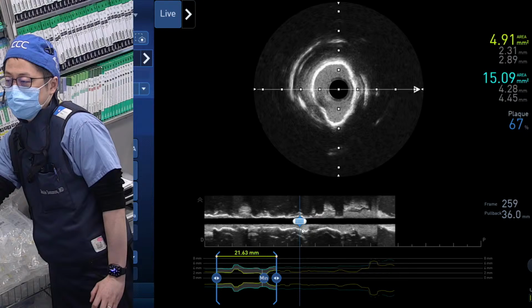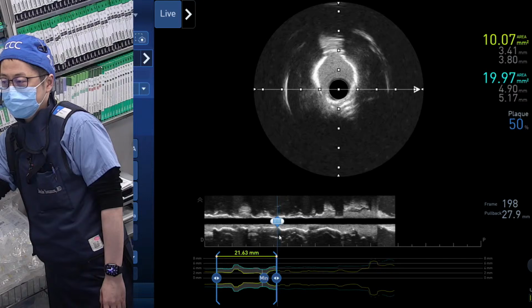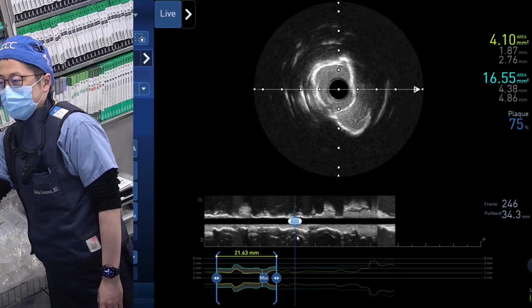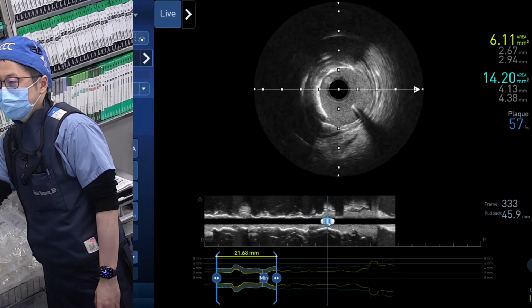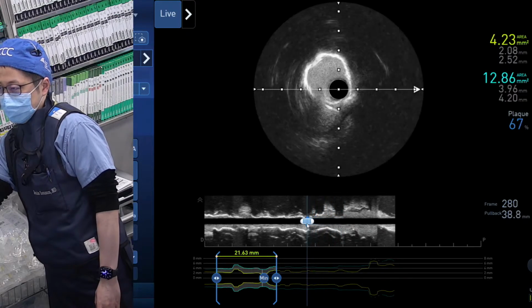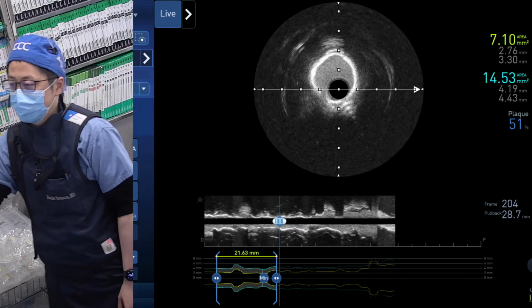Proximal LAD looks no major fracture, so I think it's a good idea to go IVL. Absolutely. But my question is, any cuts you see in that circular calcium? It might be here, but I also see at few places there is not even a single cut, right? Yeah, some cut, but maybe it has just thinned it because of the small burr. Yeah, it is a small burr.